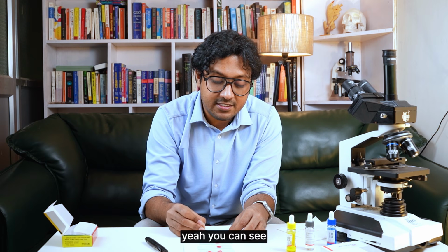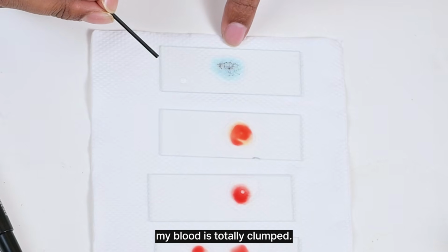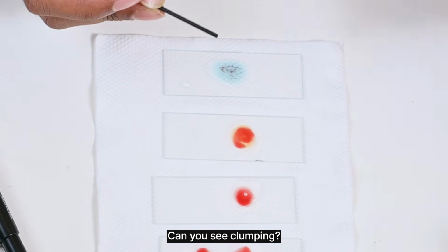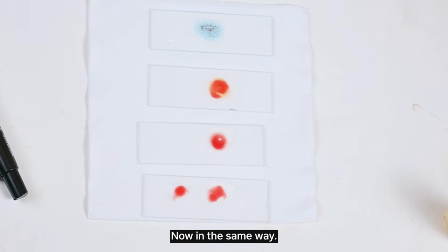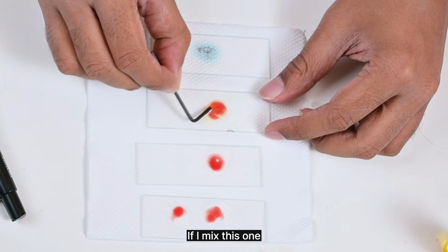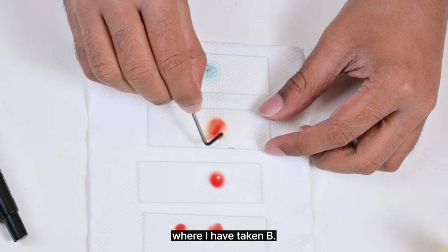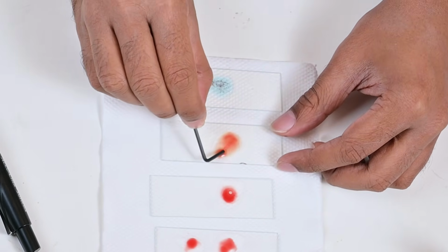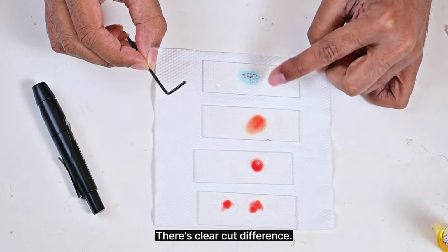Yeah, you can see my blood is totally clumped. Can you see clumping? Now, the same way, if I mix this one where I have taken B, see, there is no clumping, there's a clear-cut difference.